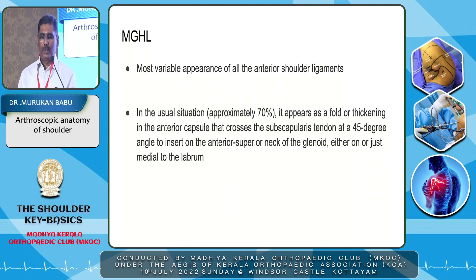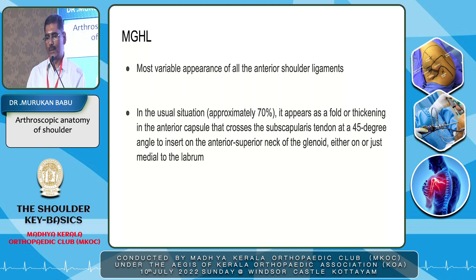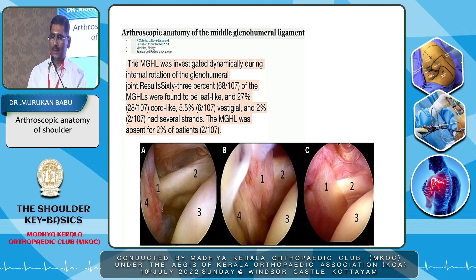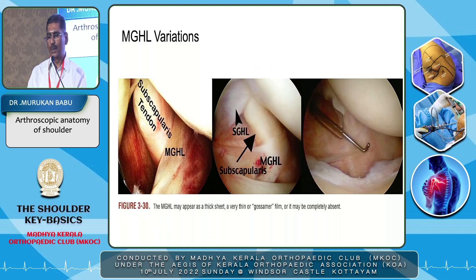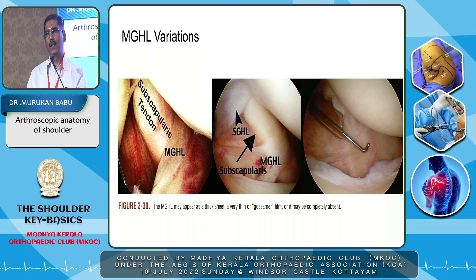Then comes the middle glenohumeral ligament — the most variable in appearance of all the anterior shoulder ligaments. In the usual situation, it appears as a fold or thickening in the anterior capsule that crosses the subscapularis tendon at 45 degrees. Sometimes it is cord-like, sometimes leaf-like — there are different names depending on the thickness. It can be a thick sheet-like structure, thin, or it may be completely absent. These are the anatomical variations of the MGHL.